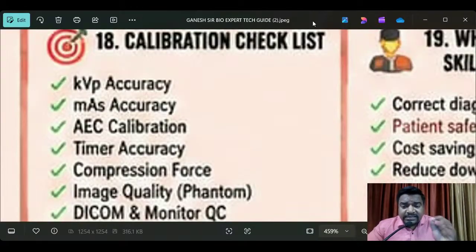What is PMS? Preventive maintenance services. So in preventive maintenance, we attend the hospital and check the list as per schedule. We have to check everything manually and physically, and check whether all equipment is fine or not, whether spare parts are good or not, whether it looks good or not, and whether there are any damages or not.